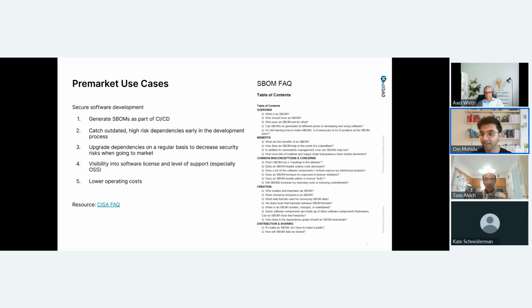So thinking, kind of going back into medtech and medical device manufacturers' perspective on what are actually use cases of SBOMs. Earlier I mentioned in the Cisco case study, Cisco does a good job of including in their DevSecOps. So it's doing things like generating SBOMs as part of your continuous integration and continuous deployment builds pipelines, allows you to stay on top of any updates the software R&D team might have made to any external dependencies being used, make sure those are still secure versions being used.